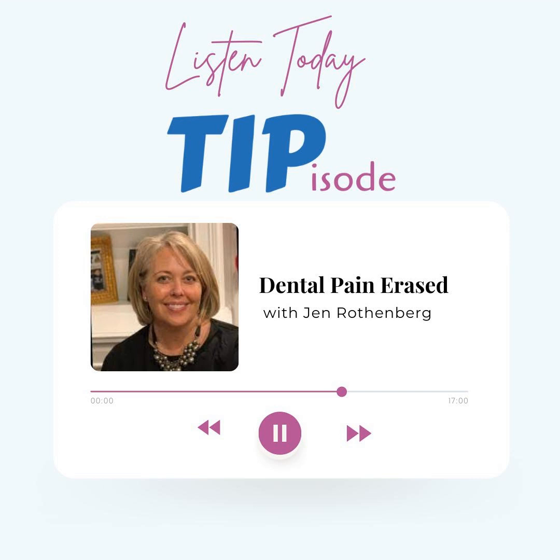So I'm going to try to describe the appearance. It's a wand-looking device, pen-shaped, marker-shaped, a little bit thicker. At the end there are 2 tips that have rounded edges, so there's not going to be anything pokey for our patients. These are just little metal steel balls. It's lightweight, very lightweight, extremely lightweight. And easy to turn on.